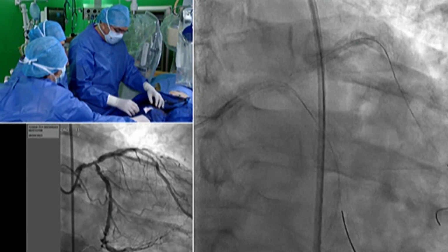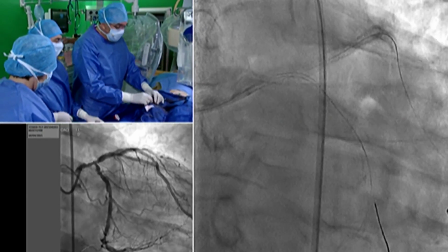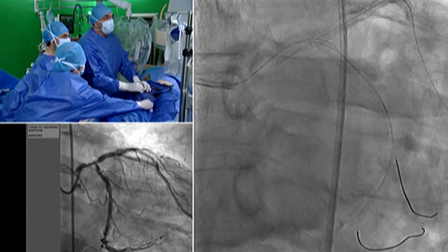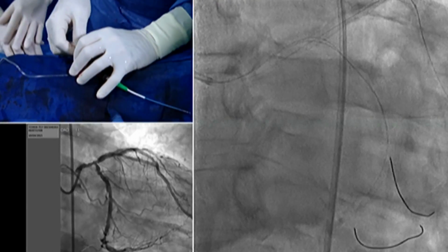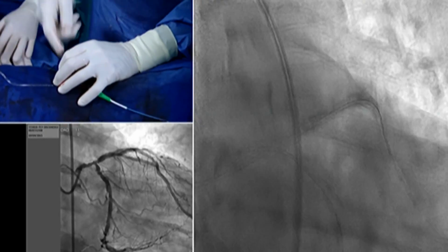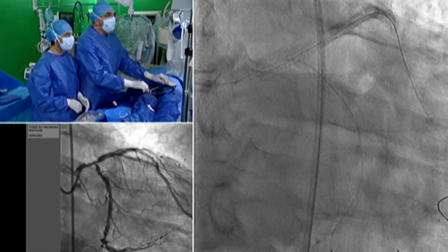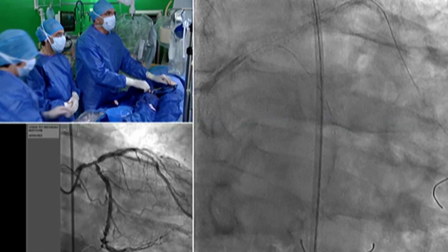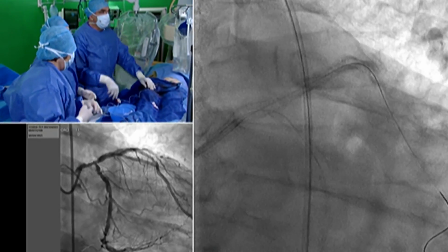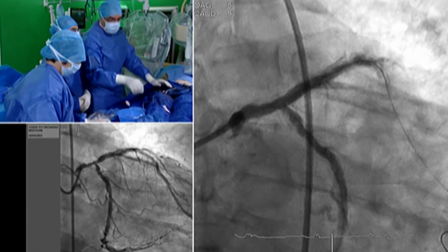And now what we will do is to remove the jailed wire. To do this, because we will have to force a little bit to remove it, I have to disengage my guiding catheter like that, and at the same time remove the wire. Okay, that's it, so this wire is out. Now, because the two wires are in the right channel, you see, we will have a better intubation of the left main. We are not blocked by the J wire, and this is now the result.